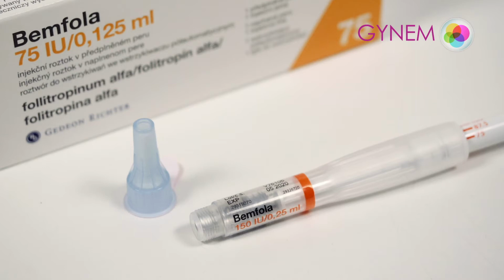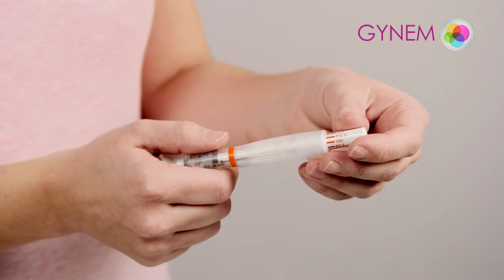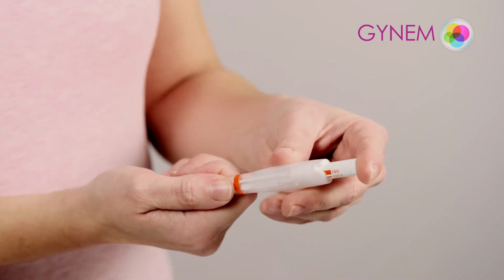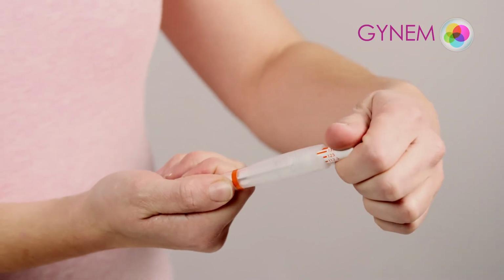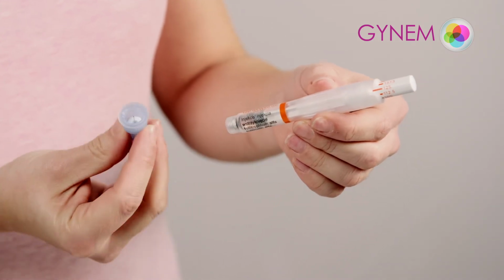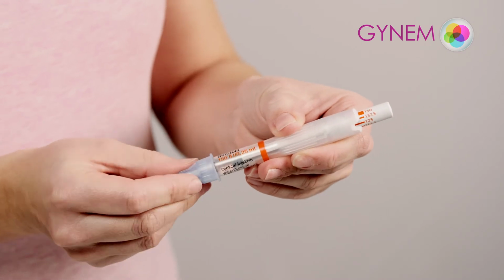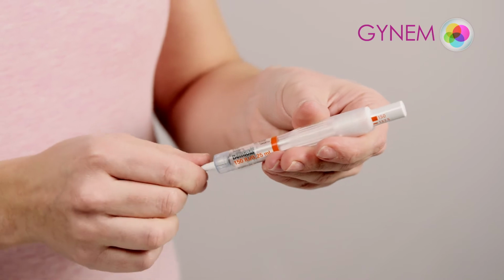Always wash your hands before using the medicine. You can see units marked on a scale on the applicator pen. Push in the end of the applicator. By turning the end of the applicator, you can adjust the dosage according to the stimulation protocol. Attach the needle to the applicator. The medicine is ready to be applied.